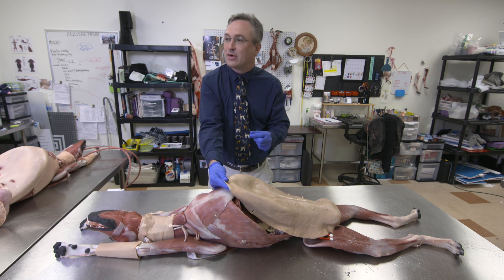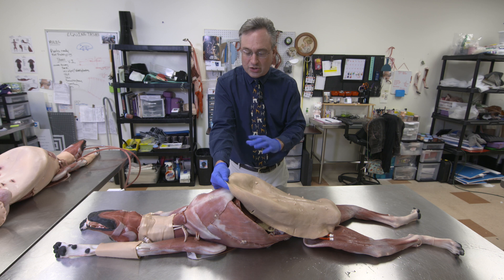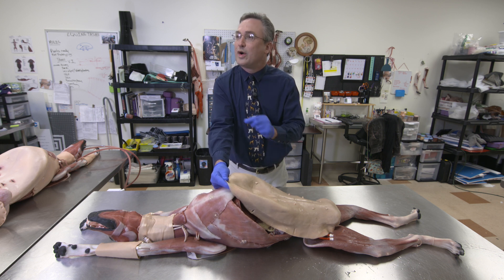Specifically, there are pathologies that we have developed into the dog so that as a good surgeon, you would do a thorough exploration of the abdomen and be able to discern what you're supposed to do.